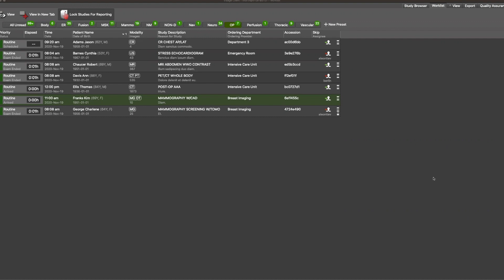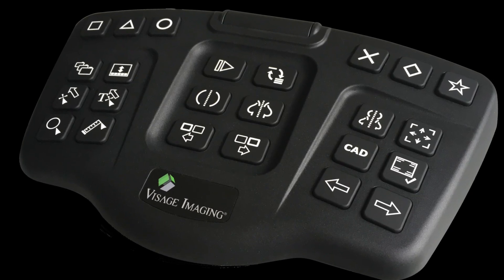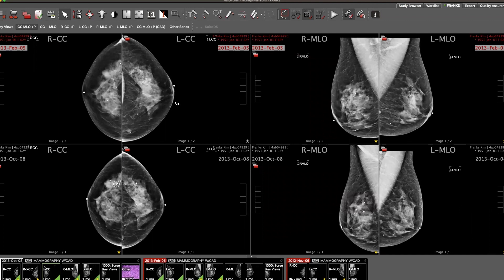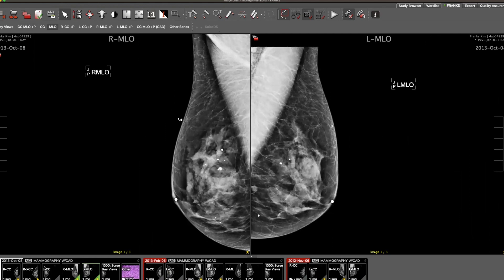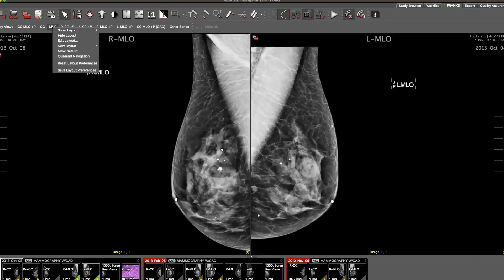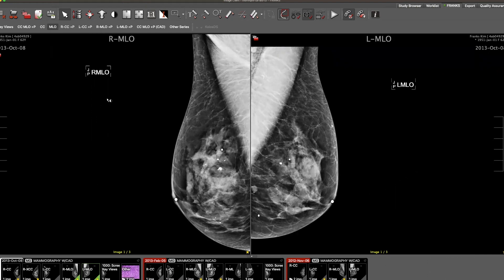The mammography workflow can be driven in Visage by either keyboard shortcut preferences or the Visage keypad. We begin the workflow with an overview layout where the priors are stacked on top going back in time and the current on the bottom. I'm going to use a keyboard shortcut to advance through the workflow. At any given time, I can use an additional keyboard shortcut to cycle in the quadrant nav mode. I can also set any of these layouts in quadrant navigation so that if I cycle to a particular layout, I'll automatically continue to cycle through the quadrant nav and then continue on with the workflow. Users can pull from a library of additional layouts available to them and organize their workflow any way they choose.